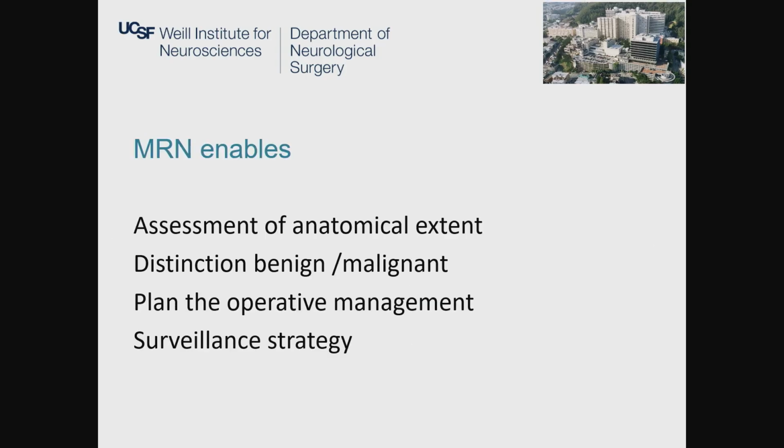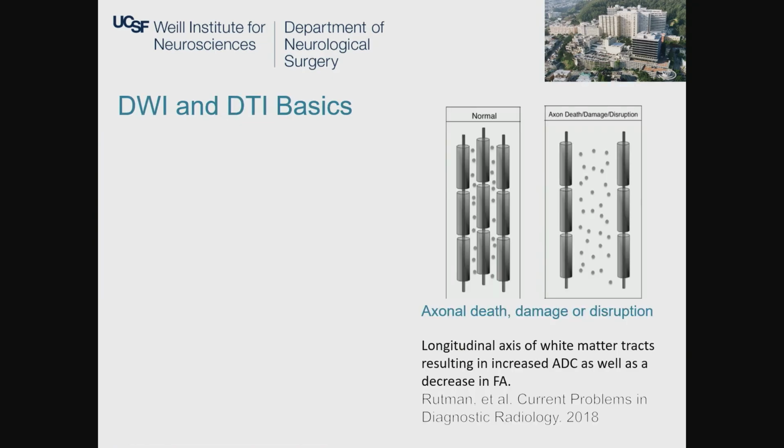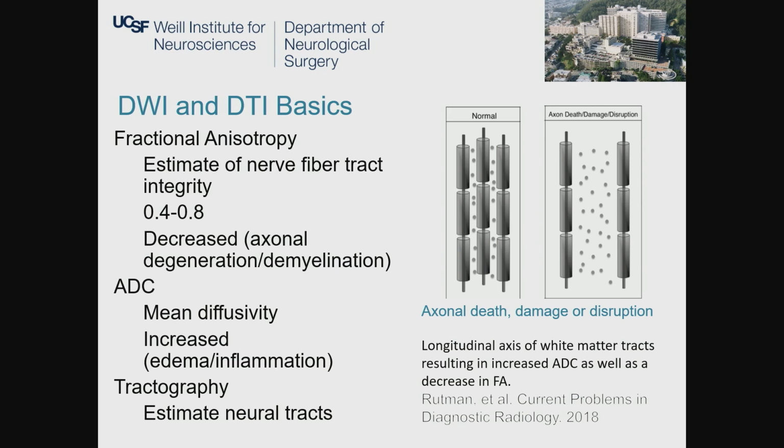So the MRN will enable you to assess the anatomical extent of the different pathologies, distinguish between benign and malignant, plan your operative management, and determine also some surveillance strategy. The MRN tractography and DTI is not new. If you look at the literature, Aaron Filler, back in 2009, has written all about the history and the origin of the DTI and the neurography and its clinical impact. What we did do, though, is really make sure that we're using it, that we are getting experience with it and getting better images as we move along.